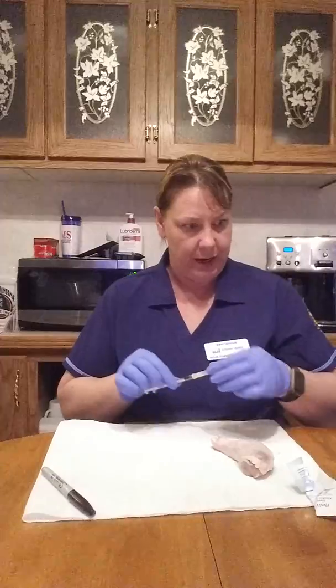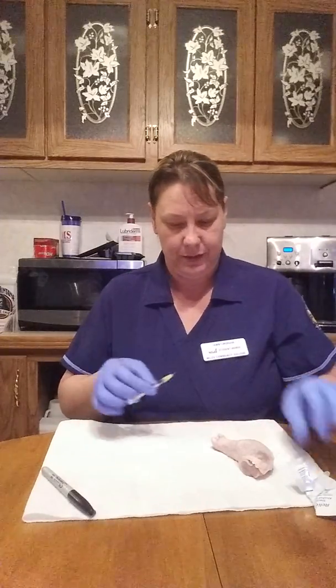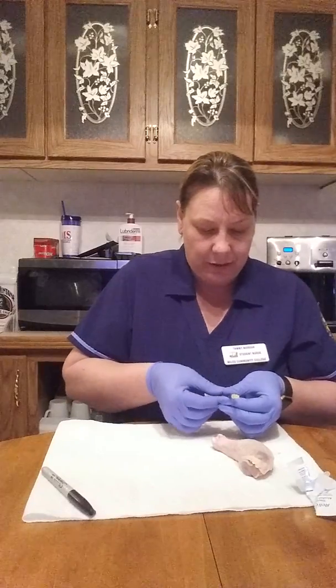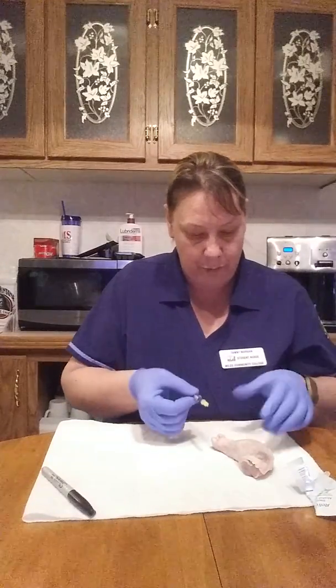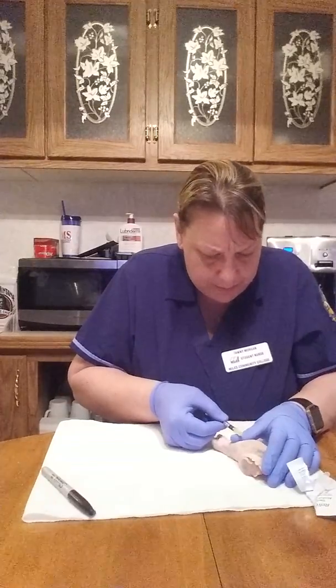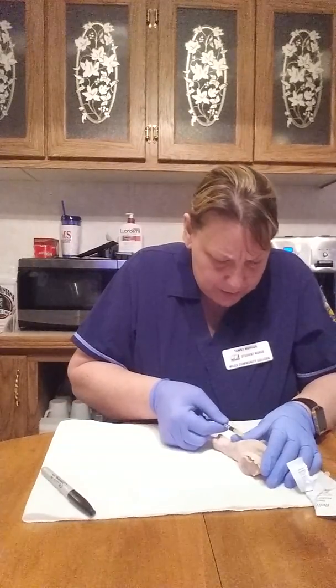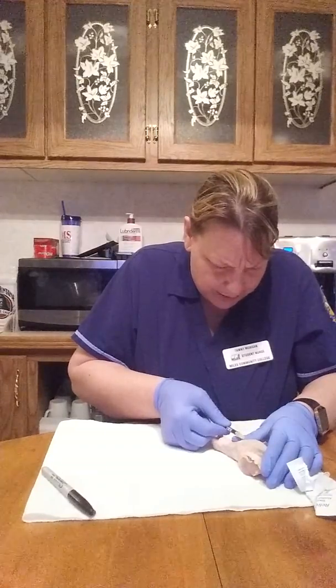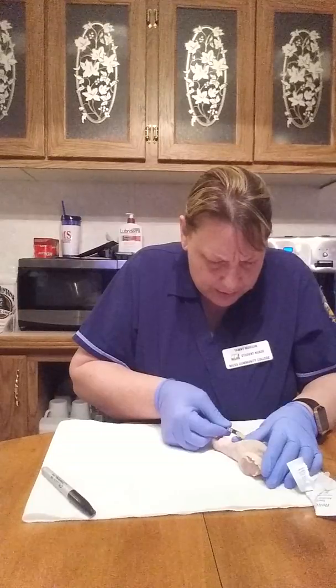But once the alcohol is dry, then I will remove the cap on my syringe. I'm going to go ahead and grab it with my thumb and my forefinger with my dominant hand, kind of pull the skin back a little bit, and I'm going to insert with the bevel up about 1/8 of an inch just under the skin.